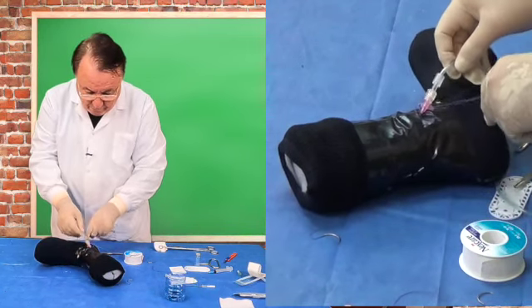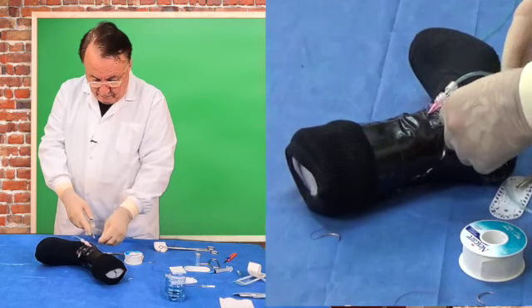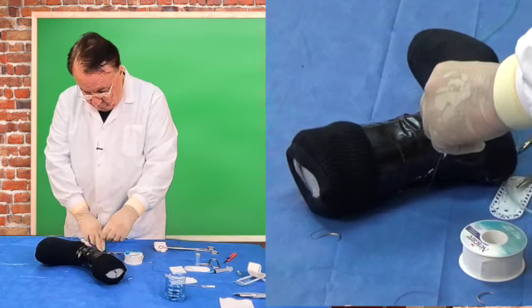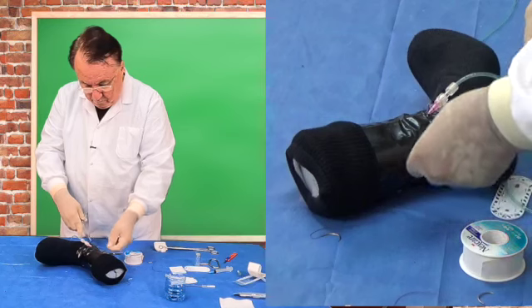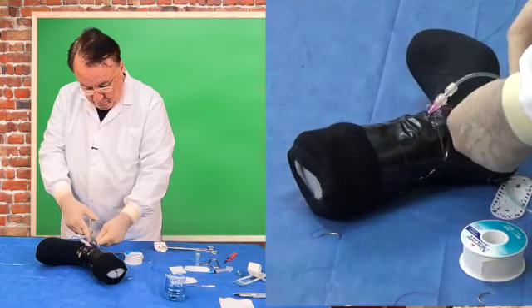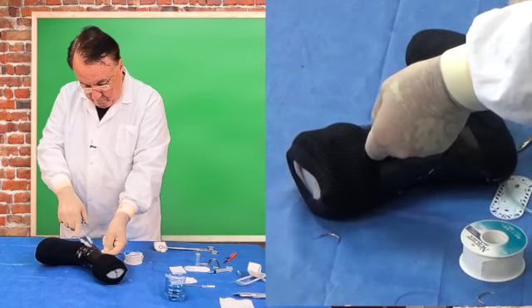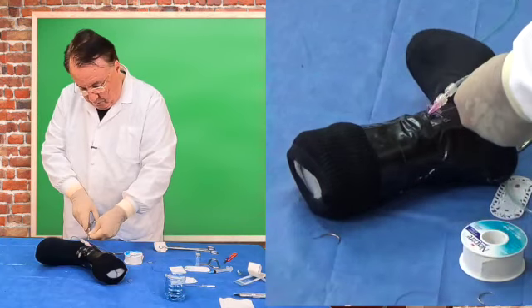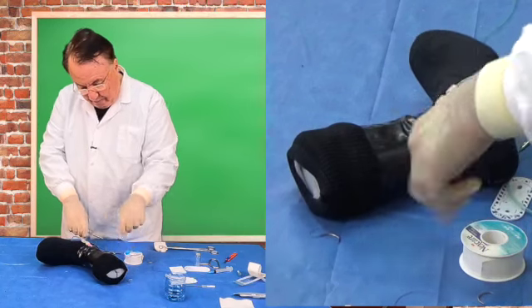And then we will do it below, and it can be a bit tighter. So we now have a long saphenous cut down.